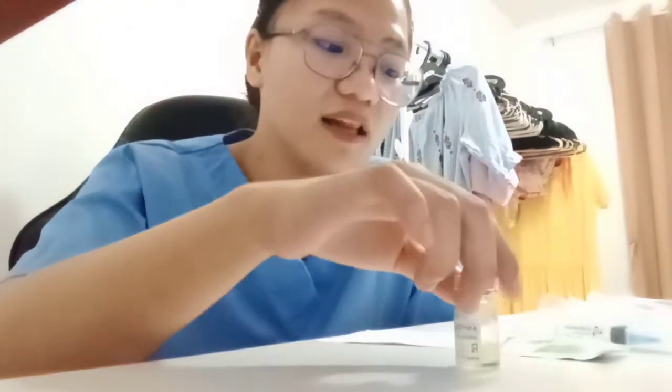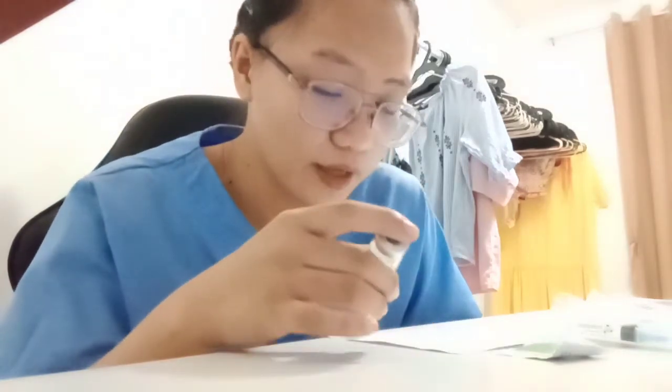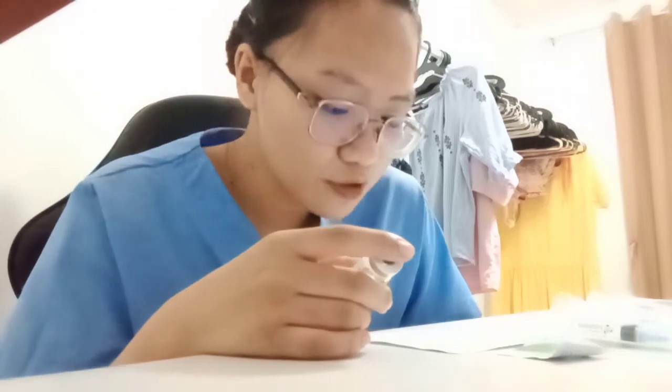Next is to prepare the materials. We have here the MAR, vial, alcohol swab, and syringe. First is to check the MAR. Compare the MAR and the label of the vial to see if they are the same, so that the medication would be the correct one.